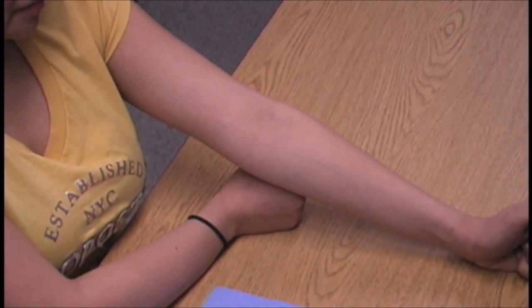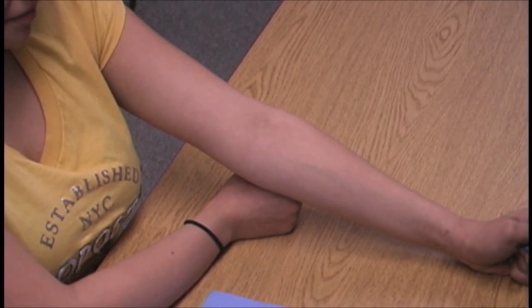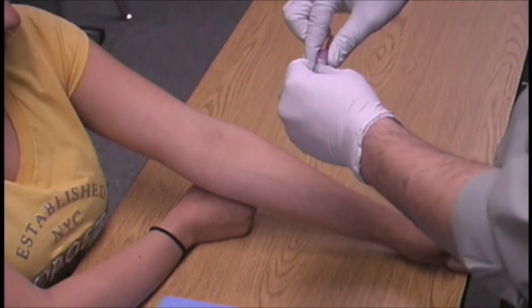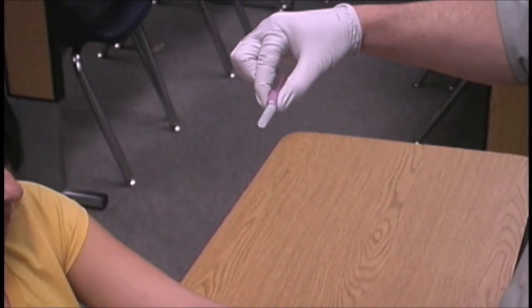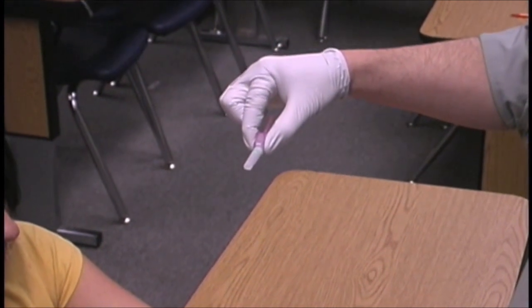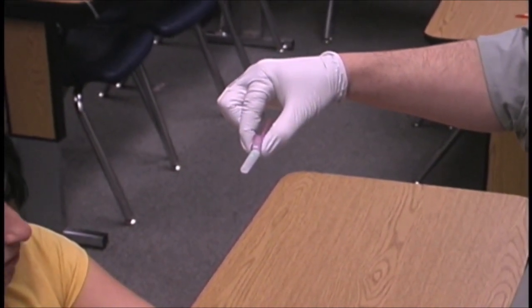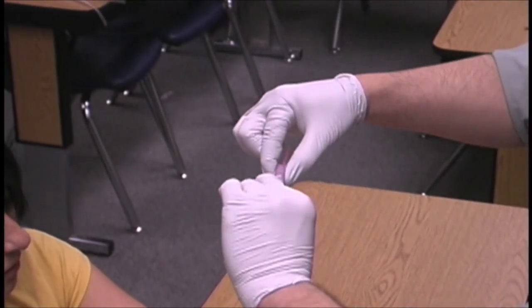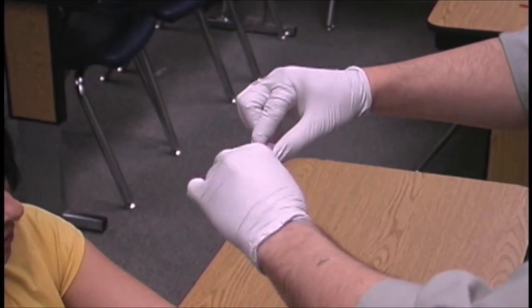Now we're going to assemble the equipment. One of the first things Al is going to pick up is the multi-sample needle. Notice how he's holding it with his thumb and middle finger towards the middle of the OSHA-approved safety device, putting pressure against the dark green cap. He's going to go to the end of the clear cap and twist it in one direction, breaking the seal.